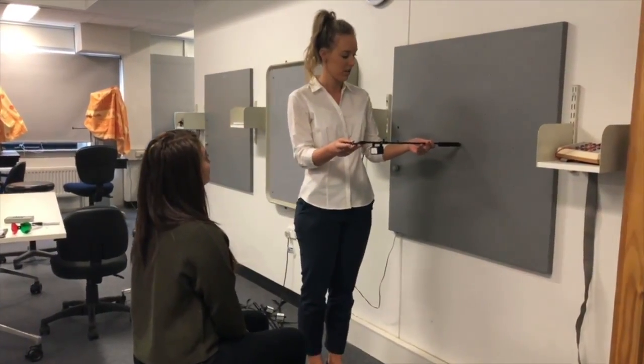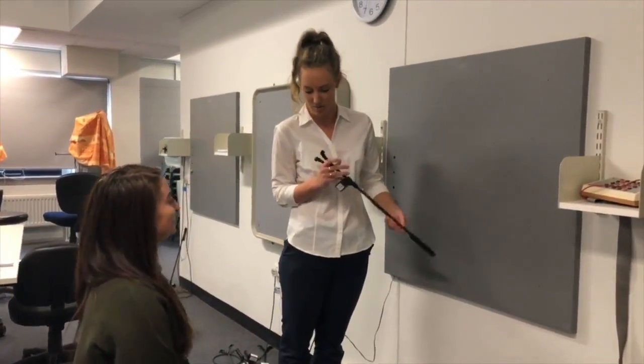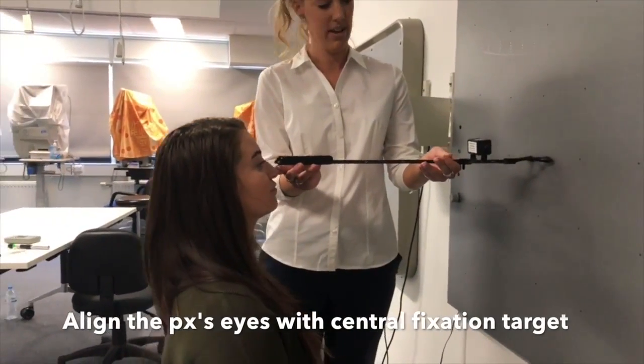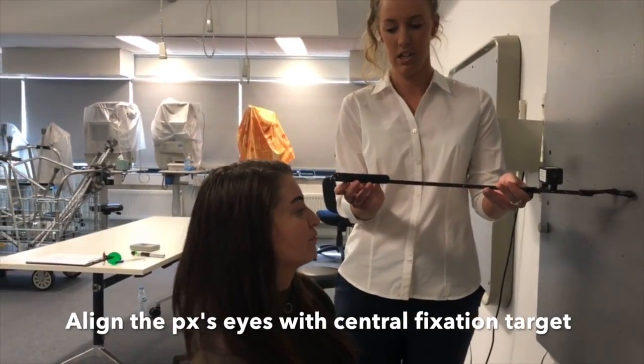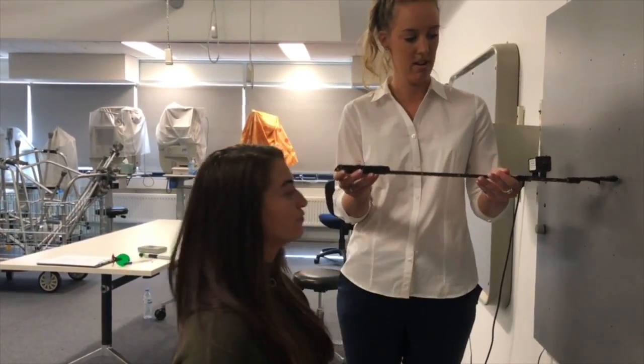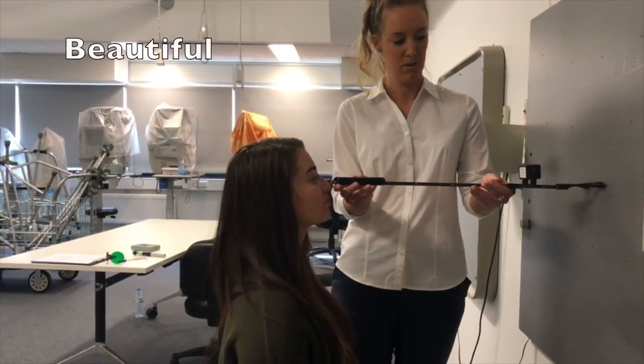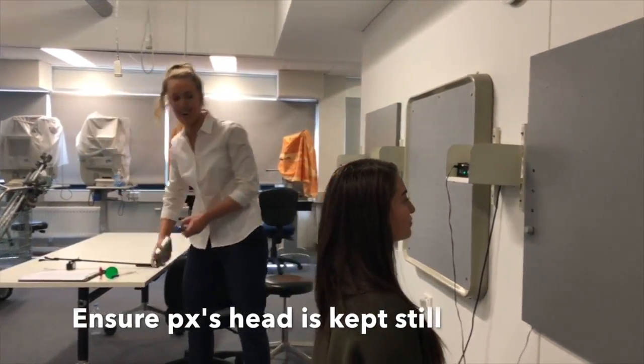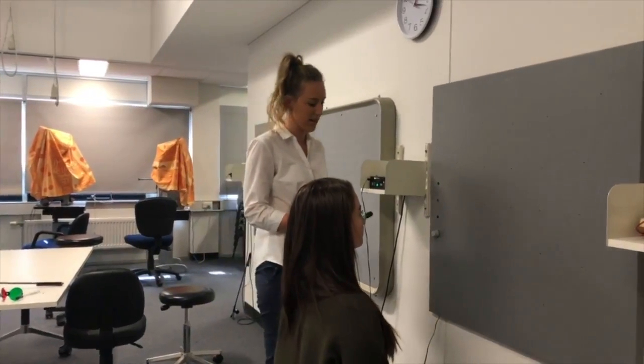So I'm going to get you to shuffle your chair in for me. And getting your nose right up to here, perfect. Now I do just need your nose here, so I'll get you to use your lever just to raise yourself up a little bit. Beautiful. Now staying as you are now, it's really important that we keep our head nice and still and we're just moving our eyes around.